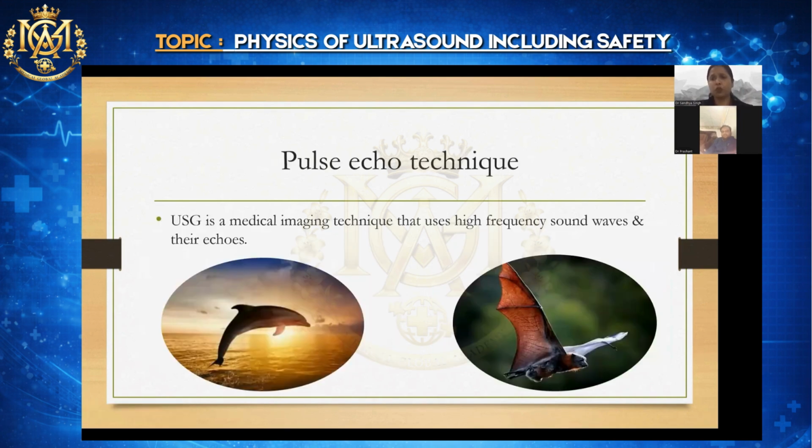Now, how did we humans understand that we can use sound waves for producing such beautiful images? Now with 4D technology, I will be showing you one live 4D video which I have recorded for you all. We understood that sound waves can be used to produce beautiful images on an ultrasound machine. See, nothing we have invented. We have just discovered what is already present. This technology, we human beings understood basically from nature itself.